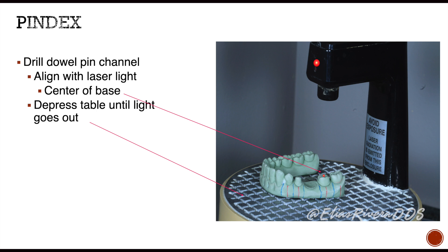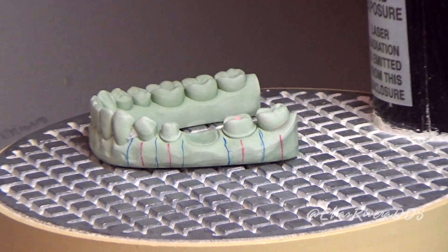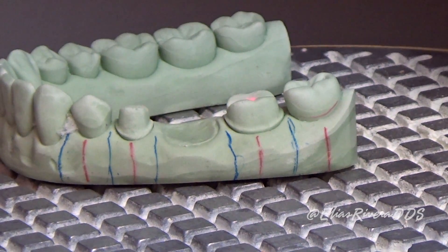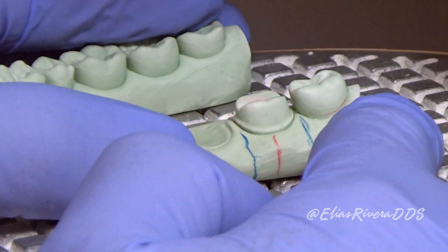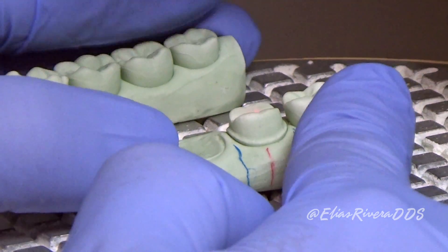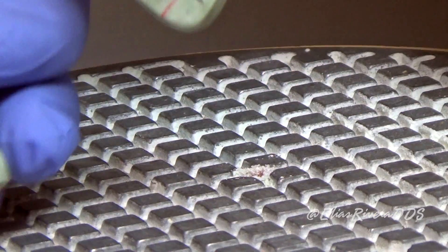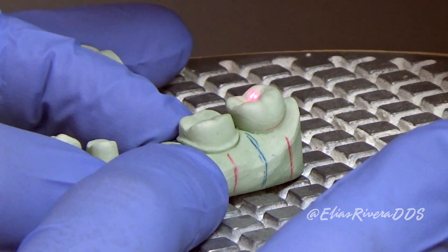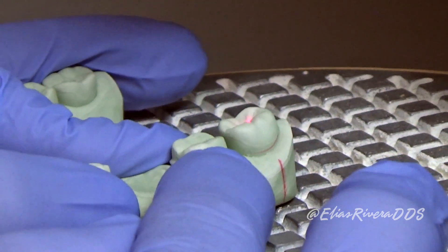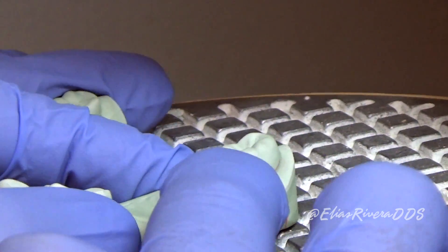We're going to use a Pindex machine to help us fabricate the dowel pin channel. Here's our cast with our reference lines. We're going to align our red reference lines using the laser. I'm going to push down until the light disappears a couple of times. We're going to do the same for every single red line we placed, also in the areas of teeth 27 and 31.